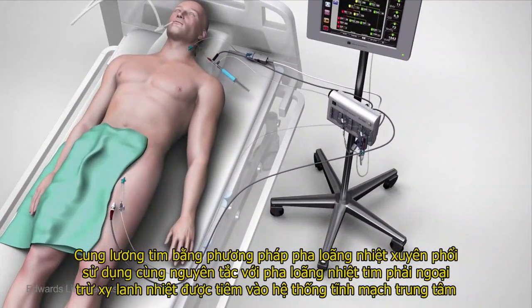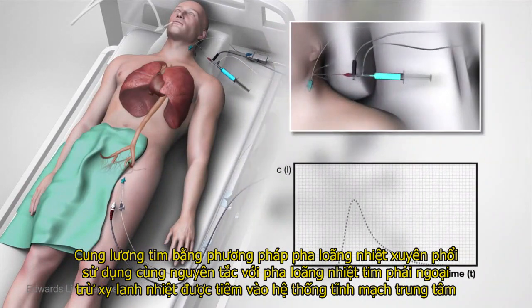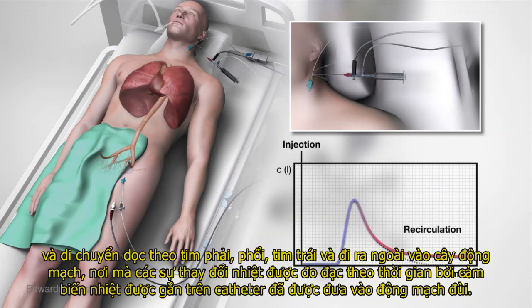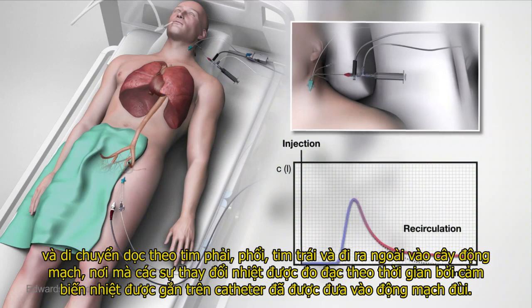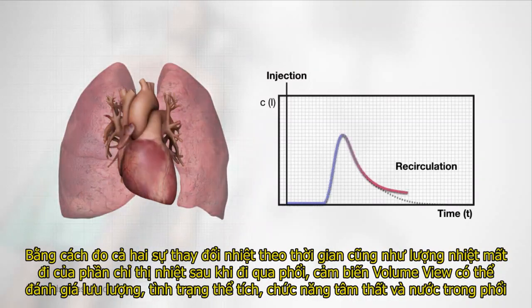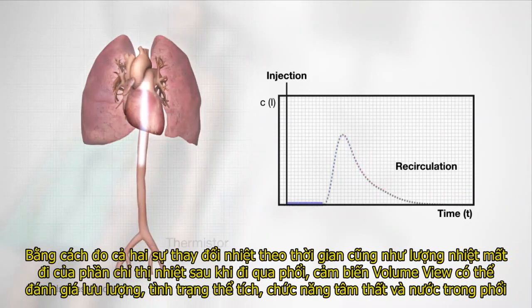Transpulmonary thermodilution cardiac output uses the same principles as right heart thermodilution, except the thermal bolus is injected into the central venous system and moves across the right heart, lungs, left heart, and out into the arterial tree, where the thermal change is measured over time by an embedded thermistor on a catheter inserted into the femoral artery. By measuring both a change in temperature over time as well as heat loss of the thermal indicator after crossing the lungs, the VolumeView sensor can assess flow, volume status, ventricular function, and lung water.